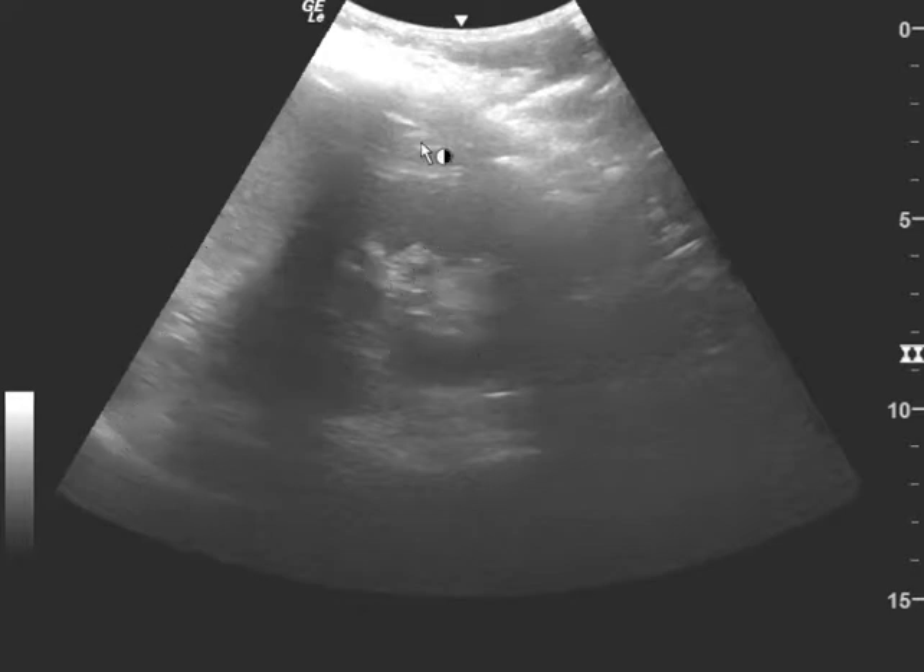There's too much focus on the kidney when you want to focus on the space between the spleen and kidney. To me, the left is limited, just because you're a bit more towards the feet or caudad. Had you gone more towards the axilla or cephalad, I think you would have seen what you needed to see.